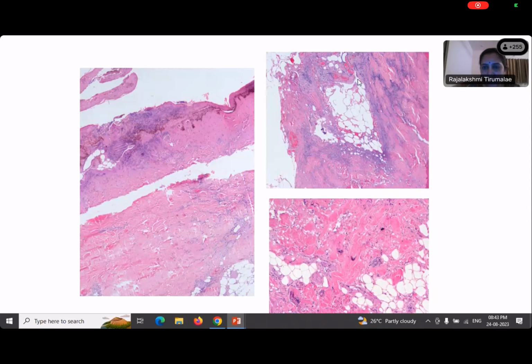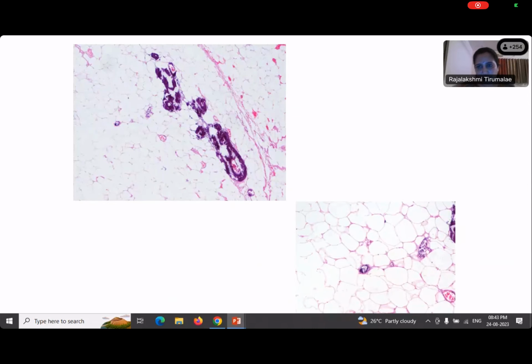And we could see these fat lobules, which looked very small. And there was what looked like early calcification around them. You can see these speck calcifications. And we said, we really can't make out much. And then we asked for a repeat biopsy. So they did go and they gave us a deeper biopsy. And this is what we saw. So I'm going to ask you all to type in your diagnosis now.